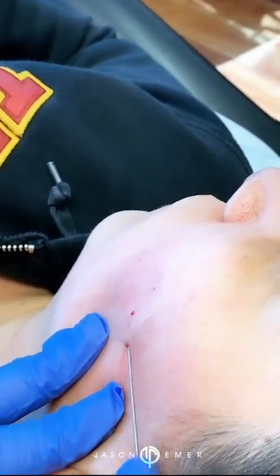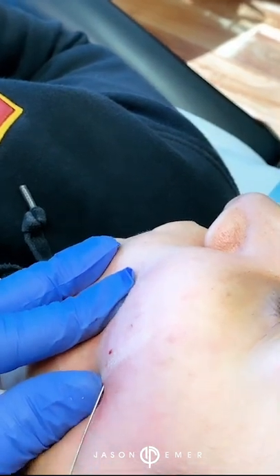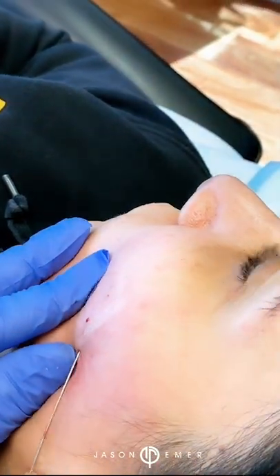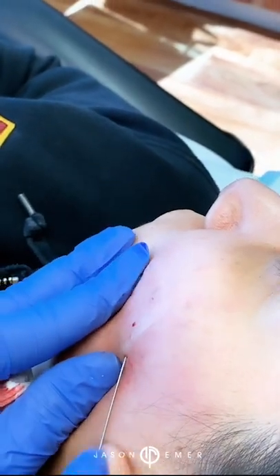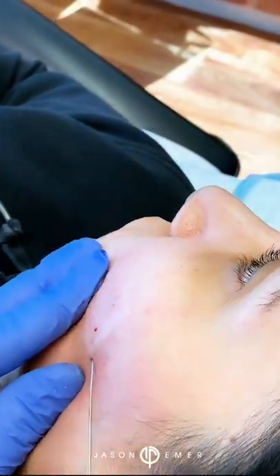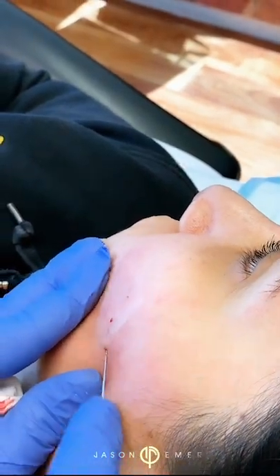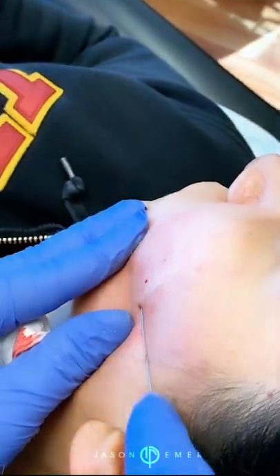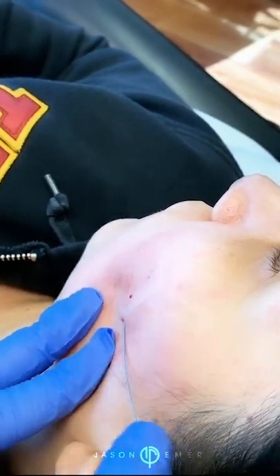And when you pull out, there's literally no bleeding, and that's because we're using a cannula. In the old days, we used to use a no-core needle, which was a very sharp needle with a razor blade on the end, and that would cause a lot of damage to the tissue. Now, when we do this, she'll get bruised and a little swollen, but it's not nearly what it was before.